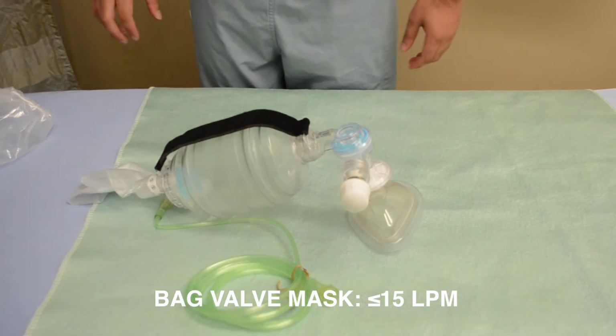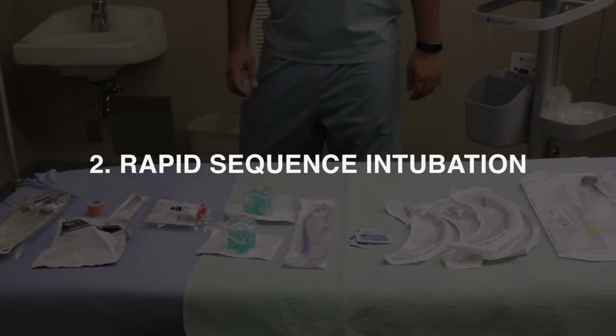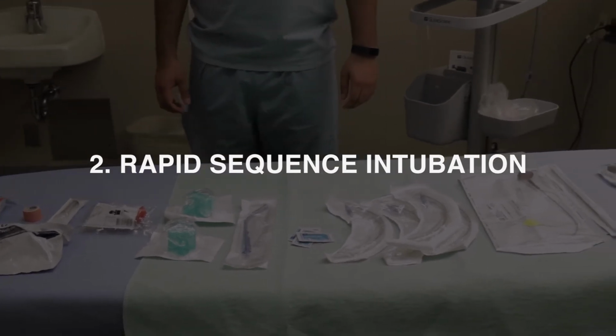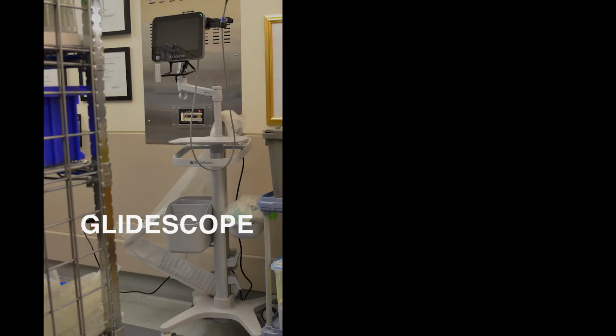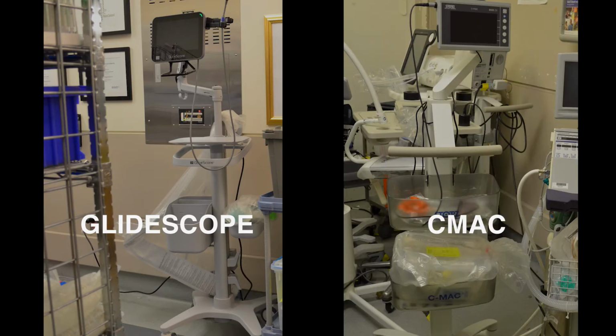Rapid sequence intubation with video laryngoscopy is the standard of care for COVID-positive patients who require intubation. Rapid sequence intubation should involve a plan A, B, and C in the case of an unanticipated, difficult airway. Plan A involves video laryngoscopy. Our department has both a glide scope and a CMAC video laryngoscope.